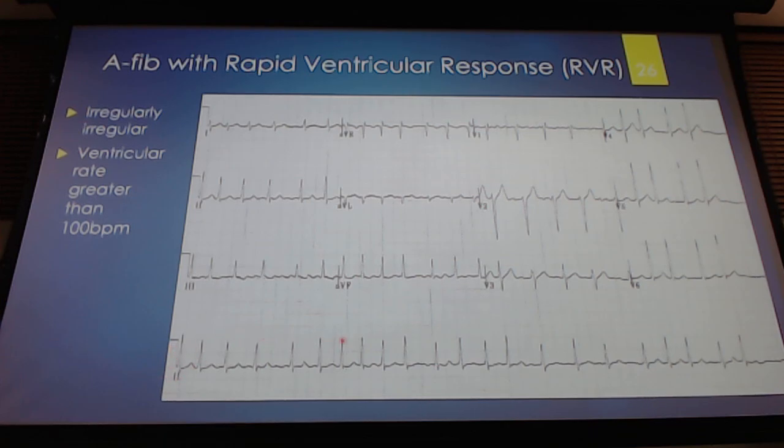And the R to R said, okay, I've got a tachycardic rate. It's irregular. What about my P waves? Am I seeing P waves in here? Well, I see a T wave, it looks like here. There's something here, but I don't really see any clear P waves. Maybe this is a P, maybe it's a T. I don't really see any clear P waves looking across my strip here.